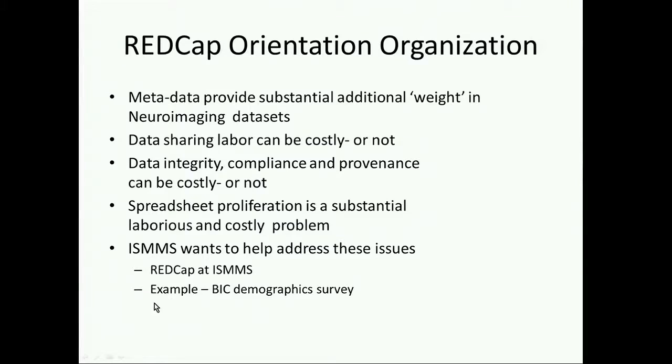So I will be speaking on behalf of everybody who services the data that you bring in. I speak from the experience of the underneath of all the bruising that goes on, coordinating all the spreadsheets that come back from the secondary data that we get as we're doing this kind of work. In addition to the imaging that we concentrate on and think of natively, we also collect an awful lot of metadata that we use to make sense of all the functional aspects of what we're doing.